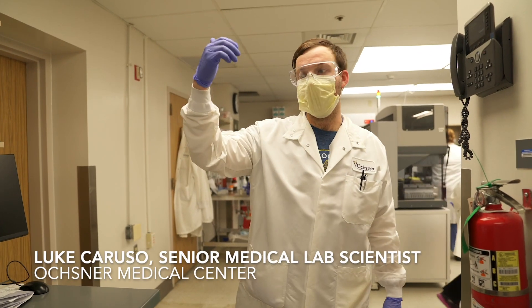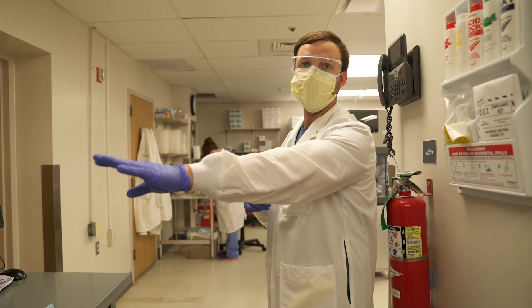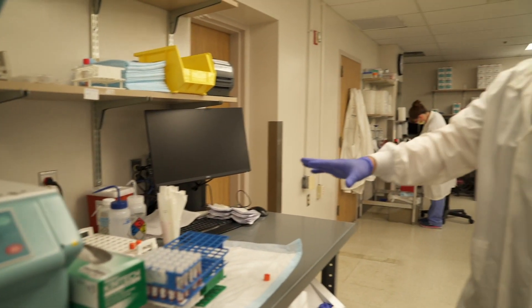Once specimens come in, after we do a heat inactivation phase to break the viral envelope, they get centrifuged right over here on the specimen prep table. We put them in racks and then they are ready to go.